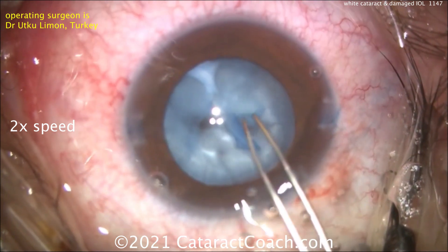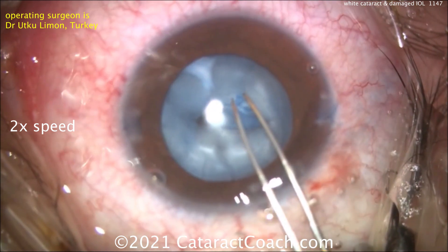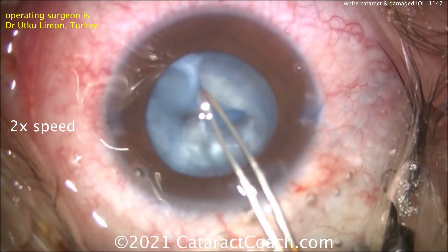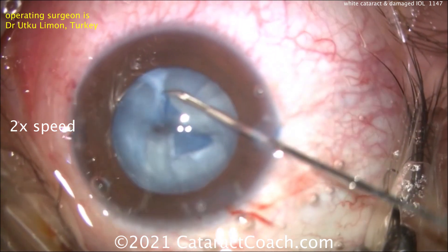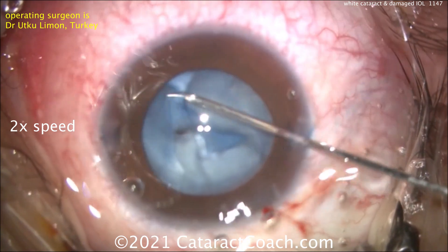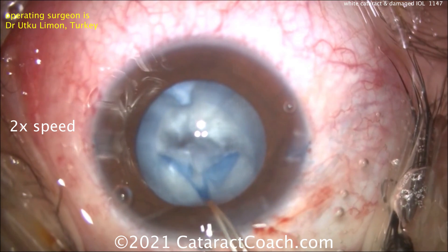Remember, it doesn't need to be a huge rhexis — you can always enlarge it towards the end after the nucleus has been removed. We're going to continue it here, and here's where it's going to get caught on that fibrotic band, which is going to prevent it from going. Again, it can be cut with micro scissors as he's doing here, or use an MVR blade, or even use a cystotome needle.